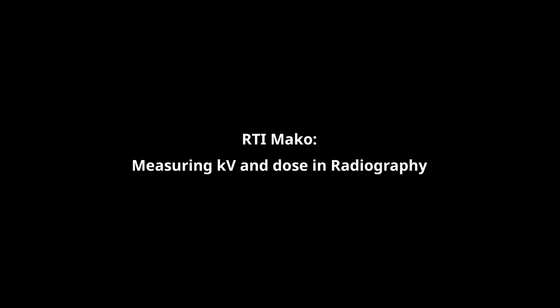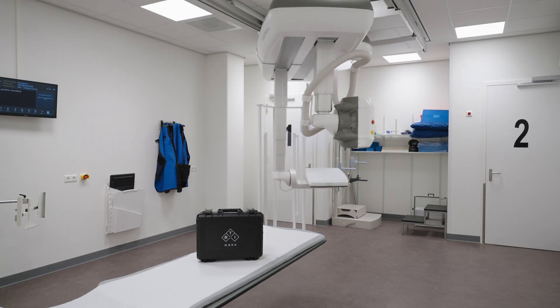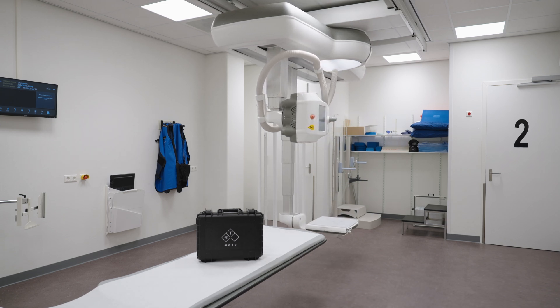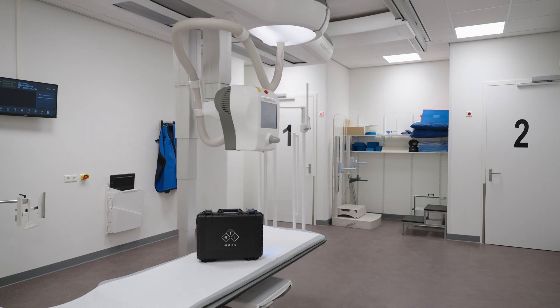In this video we will look at how to perform routine service and quality measurements with the Mako Meter from RTI Group. The Mako RF system is the most accurate x-ray test tool, measuring all required parameters across radiography, fluoroscopy, CT and dental modalities.